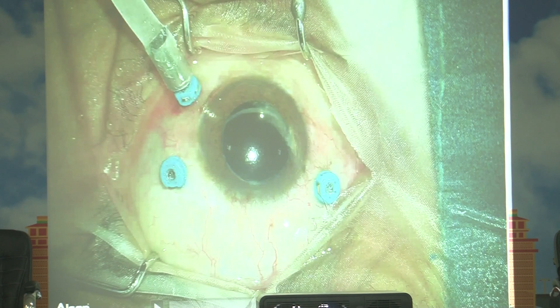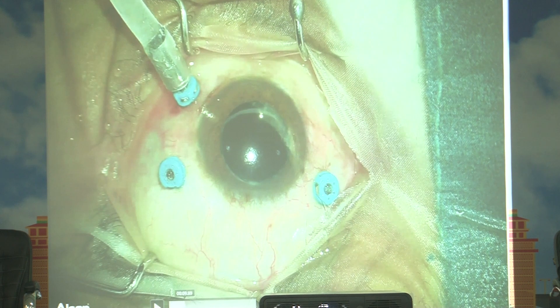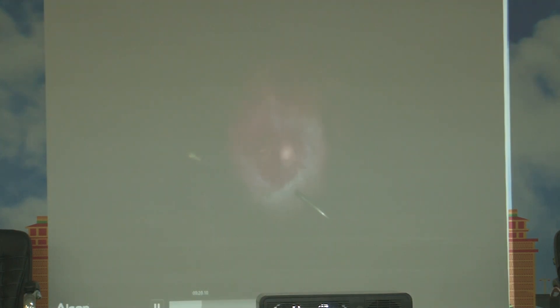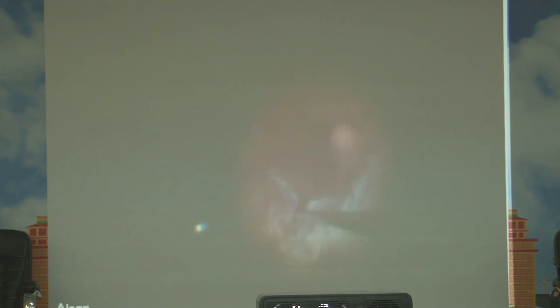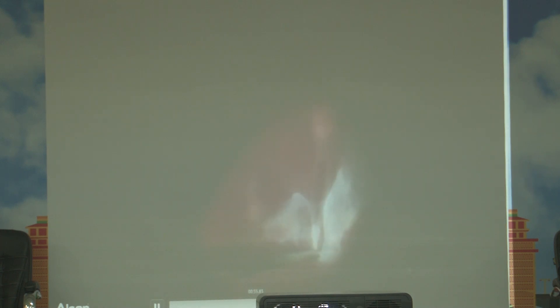This is the next case. I thought I would bring it to the interest of students and fellows. I wanted to show how the multifunctional cutter works here — this whole surgery was completed with the help of the cutter itself. This is the segmentation we are trying to do, thanks to these 25-gauge and 27-gauge 10K cutters and their curved ends, which act like forceps. You can see I am trying to do segmentation and delamination with the cutter itself.